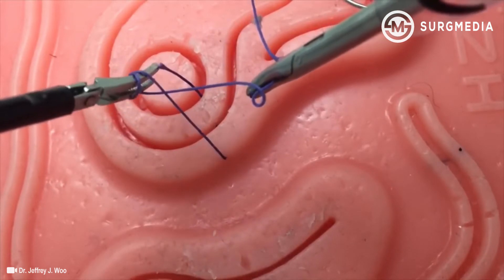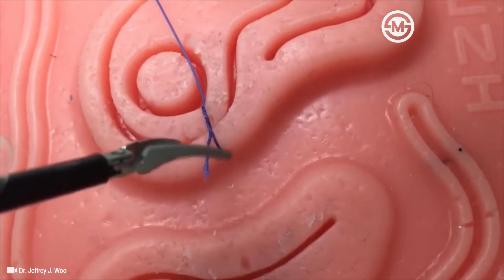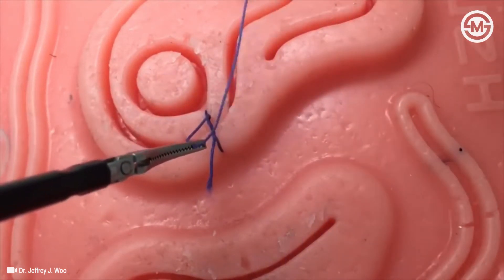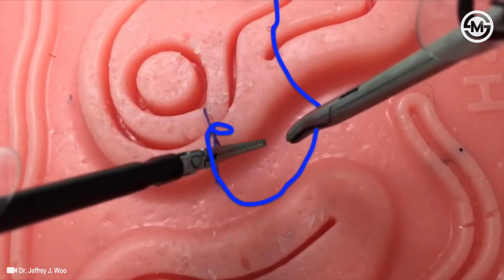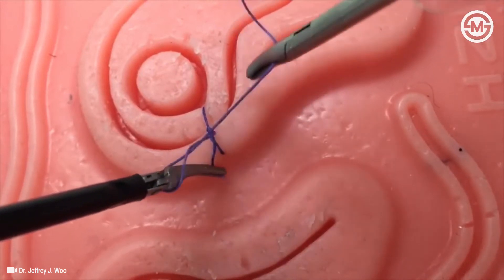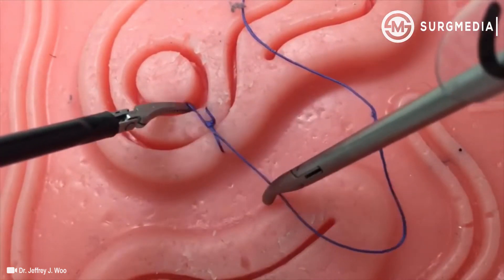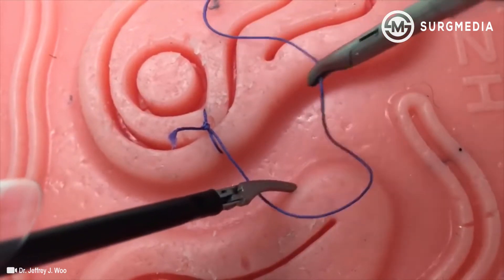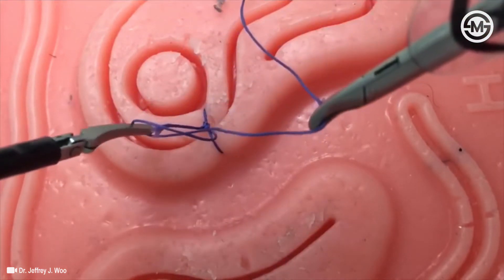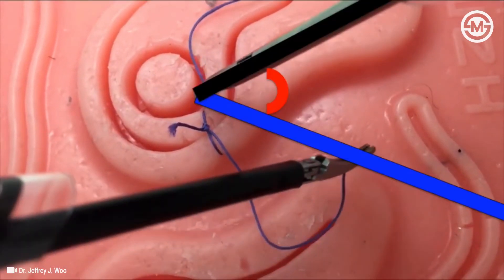Then, grasp the loose end with your left instrument while pulling upward while your right instrument pulls downward. Once the knot has been secured, create a second elongated U. In order to tie in a square fashion, place your left instrument outside of the U, then twist the stitch to wrap around your left instrument. Grasp the loose end with your left instrument and again cinch down the knot. On this last throw, the elongated U is again created and the instrument is placed inside the U, but due to this large instrument to suture angle, the loop slipped. Efforts must be made to minimize the instrument to suture angle in order to tie with ease.